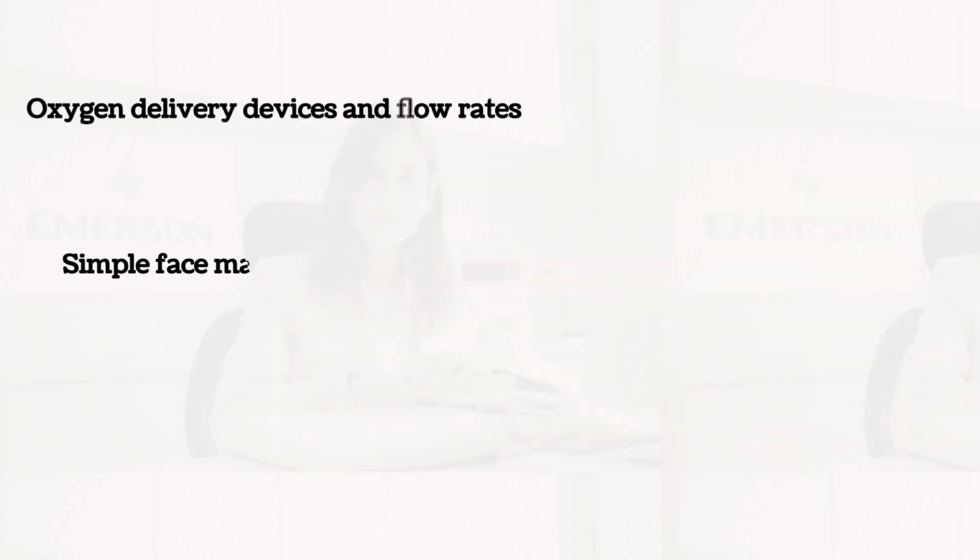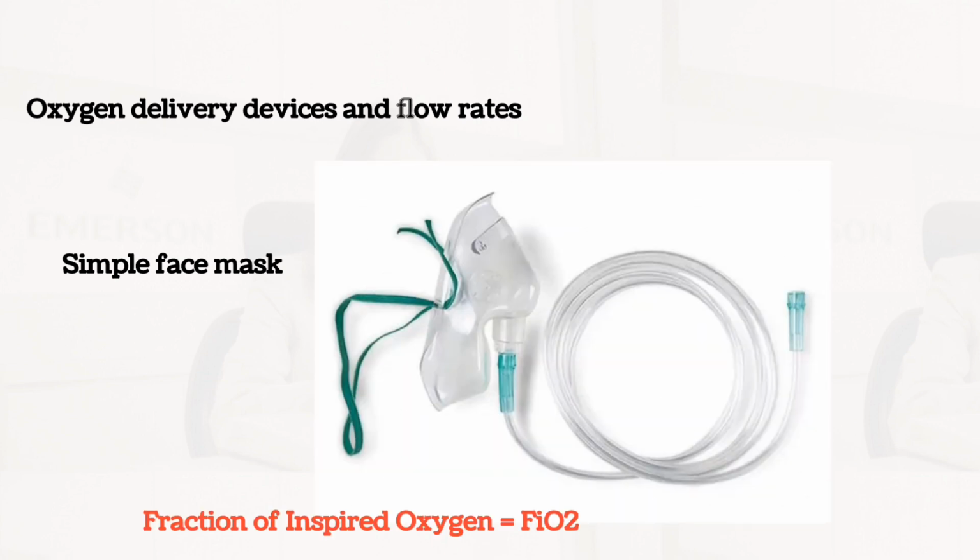Simple face mask. The oxygen delivery of simple face masks is highly variable depending upon oxygen flow rate, the quality of the mask fit, the patient's respiratory rate and their tidal volume. Simple face masks can deliver a maximum FiO2 of approximately 40%–60% at a flow rate of 15 L per minute. These masks should not be used with flow rates less than 5 L per minute.